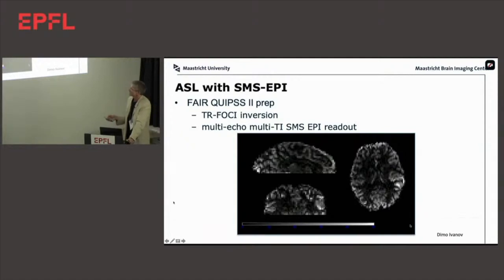And then depending on what you want to measure, you can do a multi-echo, multi-TI readout to make it faster. We put multiband in it and got it to reasonably reconstruct on the scanner using Boston's C2P stuff, which is really nice. So you can really get the images fall out of the scanner immediately, which is worth a ton. Anyway, so those are these sort of maps.